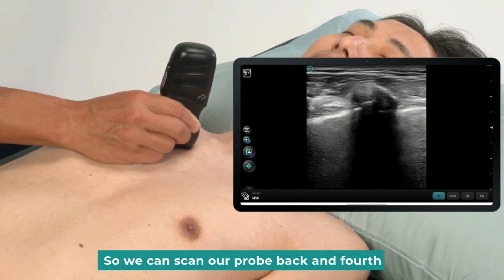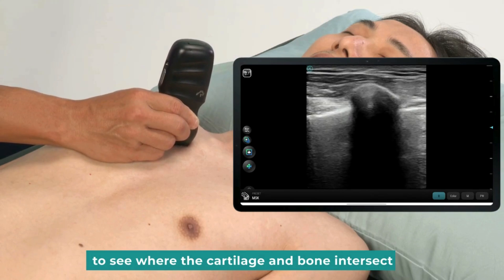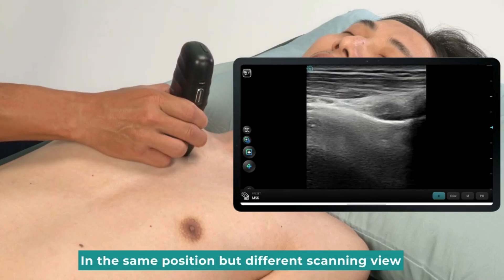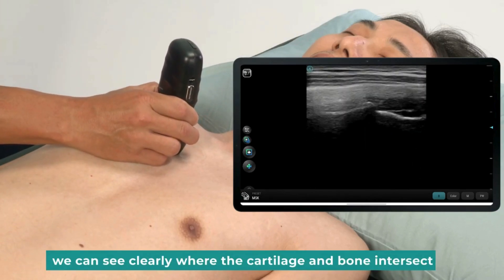We can scan the probe back and forth to see where the cartilage and bone intersect. We can now turn the probe to the long axis direction. In the same position but a different scanning view, we can see clearly where the cartilage and bone intersect.